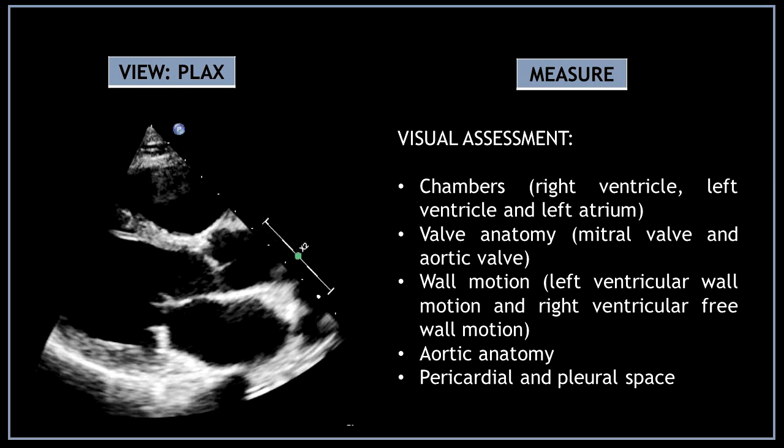First, obtain a parasternal long axis view and perform a visual assessment of the cardiac chambers — pay attention to the right ventricle, left ventricle, and left atrium. Then do a visual assessment of the mitral valve and aortic valve anatomy. Next, assess wall motion, checking left ventricular wall motion and right ventricular free wall motion. Also assess the aortic anatomy and do a visual assessment of the pericardium and pleural space.